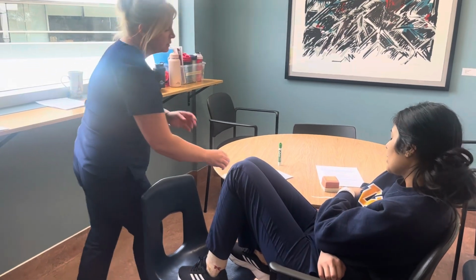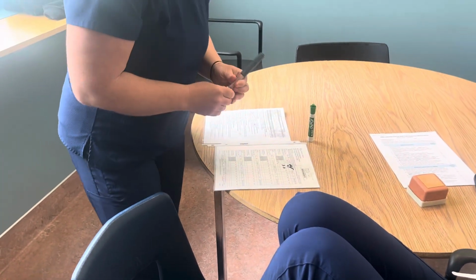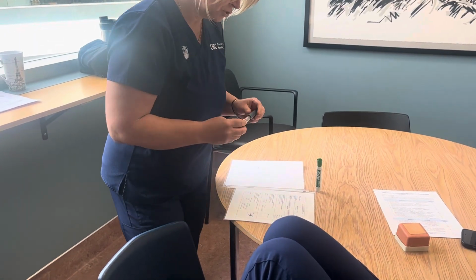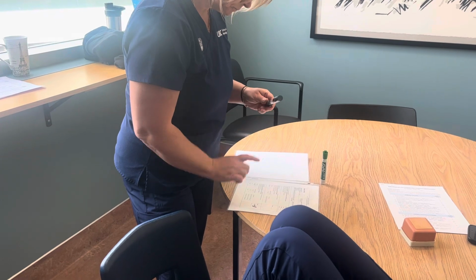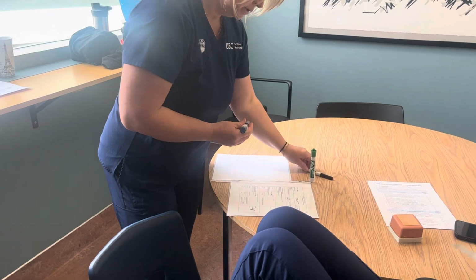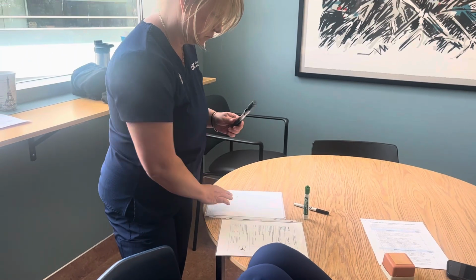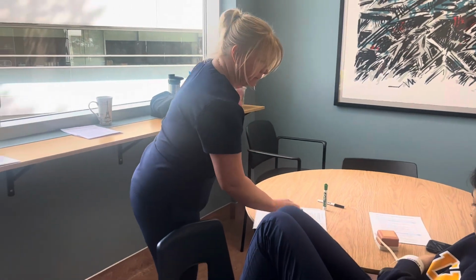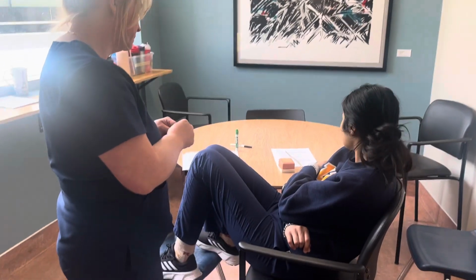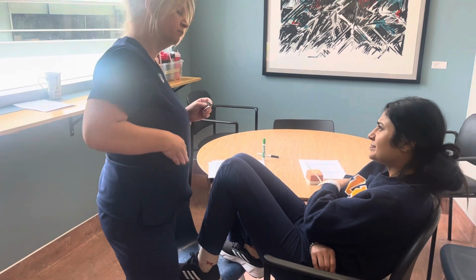Okay. So at the bedside, I would perform my third check. So I know that I've got the right patient. I've got Polly. We know that we are doing the right drug. We've got the aspart, 100 units per mil. We are doing the right dose. We know that we've got 3 loaded. That's being checked. The right time and the right route. So we are set to go. Okay. Do you have an injection site that you prefer? Okay. And do you have any questions about this drug? You've taken it a little bit before. No? Okay.